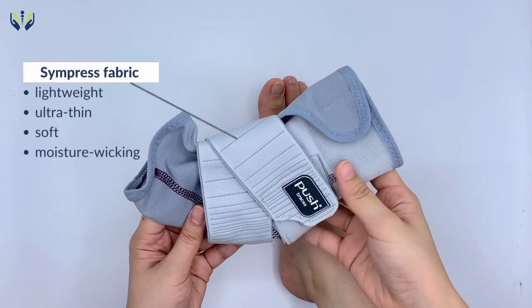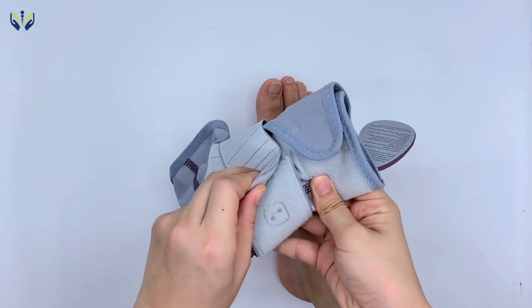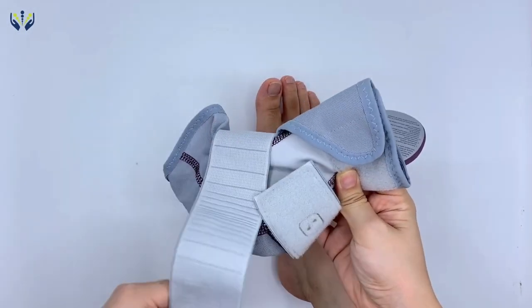Pushcare has used the innovative Simpris fabric. It has lightweight, ultra thin, soft and moisture wicking microfiber that will guarantee you a comfortable fit.